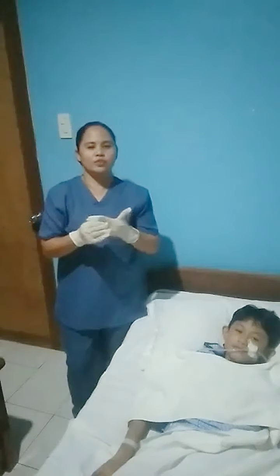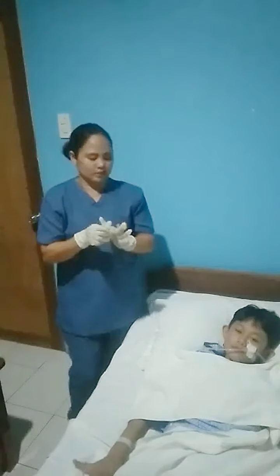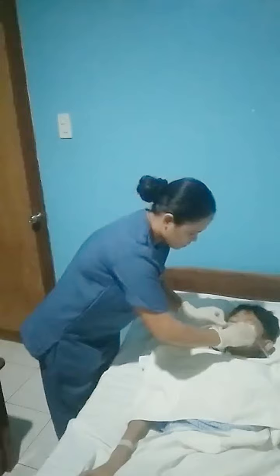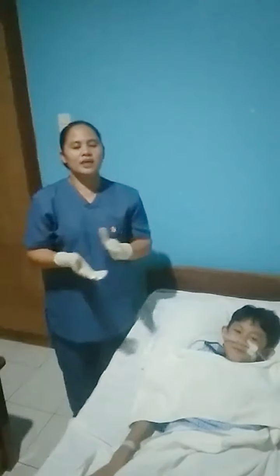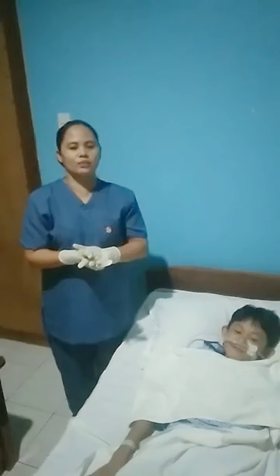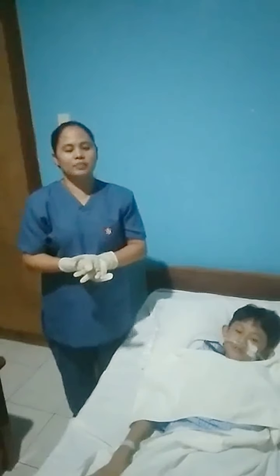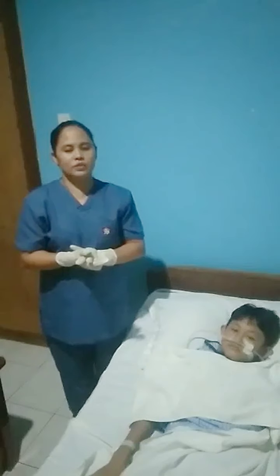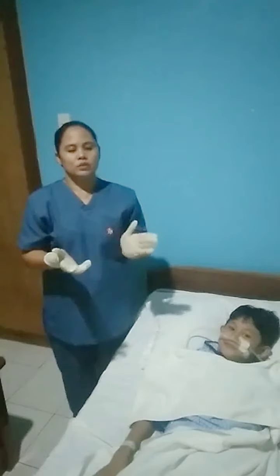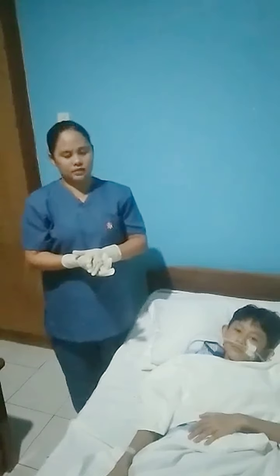After putting on gloves, we have to pinch the tube, close or plug it. That's to prevent acids from leaking. Our stomach is secreting hydrochloric acid, which is really uncomfortable, so to prevent that, we need to pinch the tube closed. The next step is to remove the tape. Coil the free end using our dominant hand, and we have to use a tissue to withdraw the tube in a smooth yet continuous motion to avoid gag reflex.